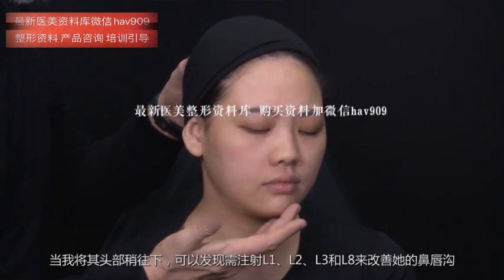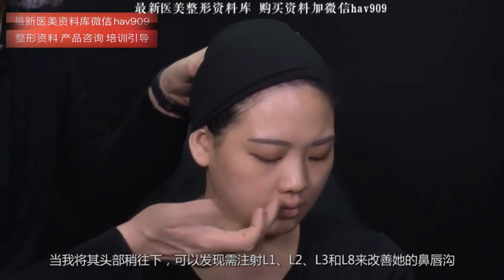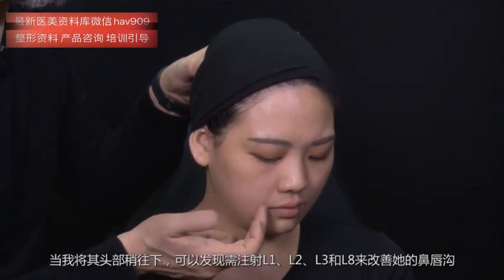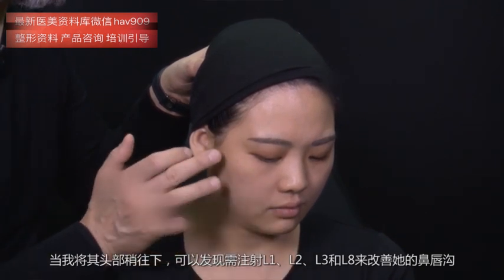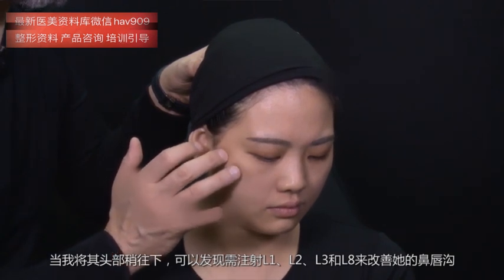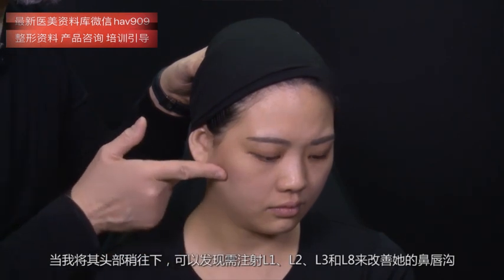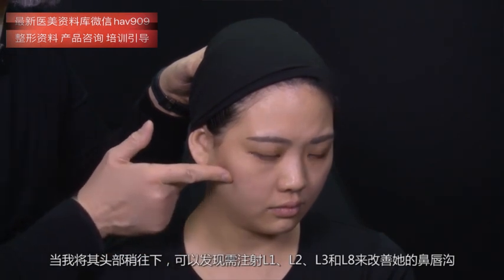When I bring a little bit lower, we notice that to improve the nasolabial folds, I need to inject L1, L2, and L3, and I also need to inject L8.